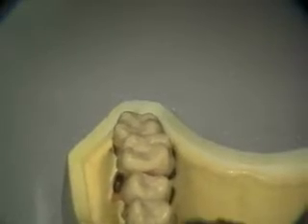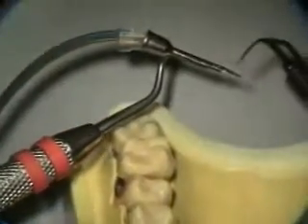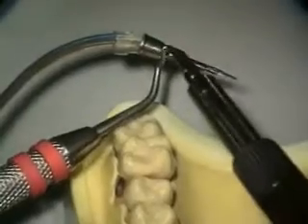Okay, so I've shifted instruments, and now I'm using the red or the right explorer, bent back to the right.